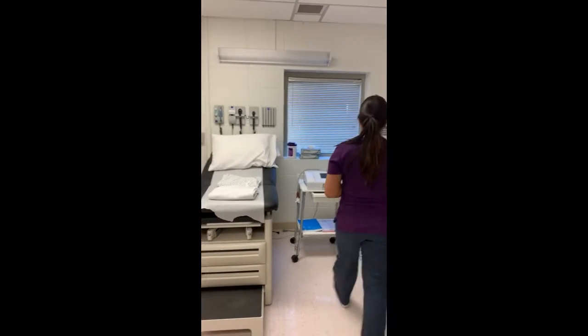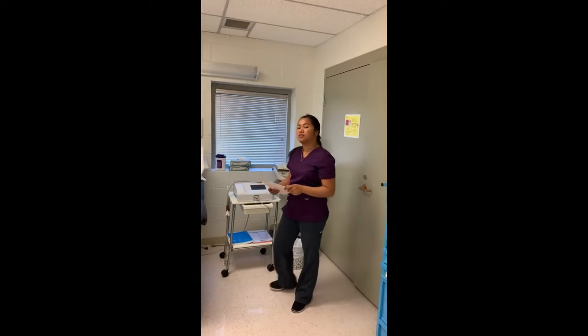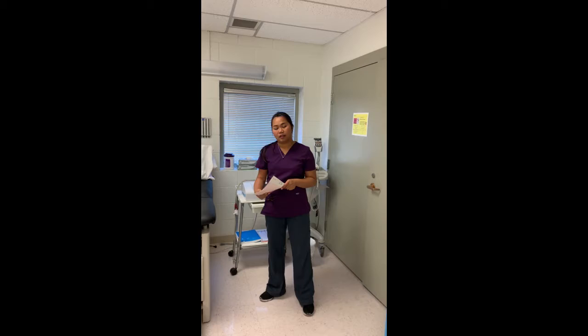Here I received the order, so I'm going to go ahead and validate it. It has the patient's name, the identification number, the date of birth, the age, the sex, the race, his weight and his height, his medical history, also any medication that he's taking for the heart. And it also stated the special conditions the patient may have.